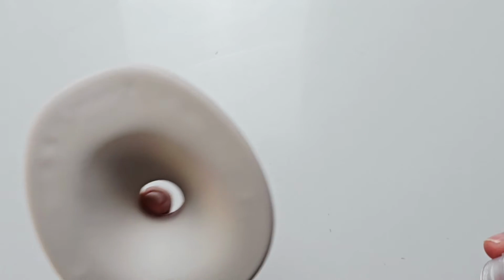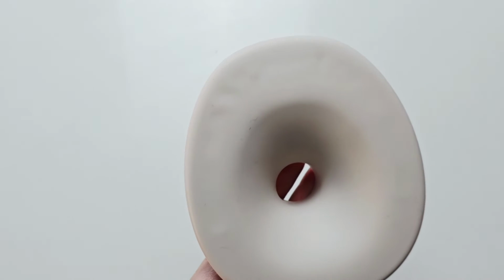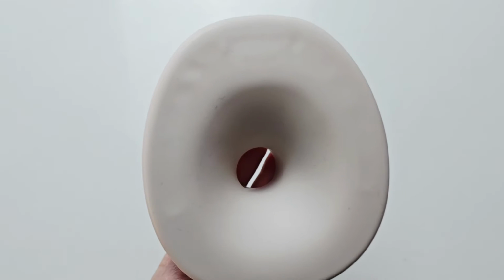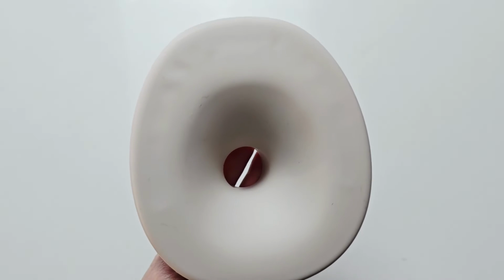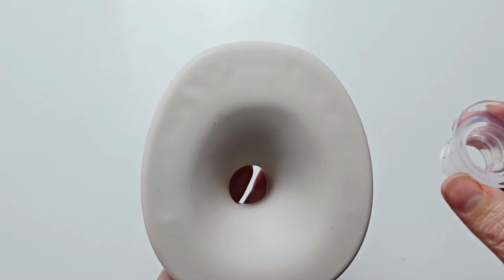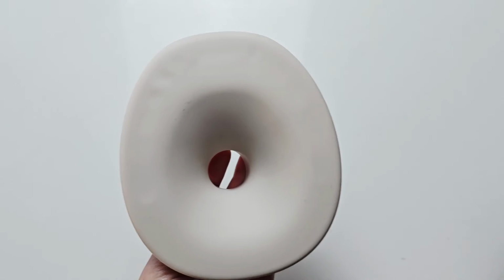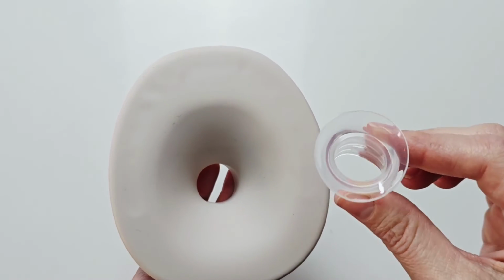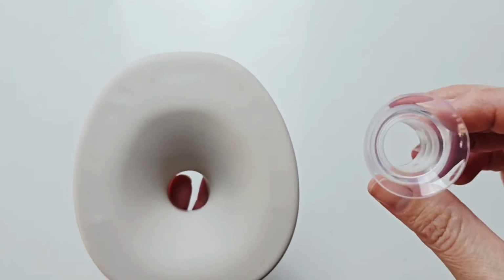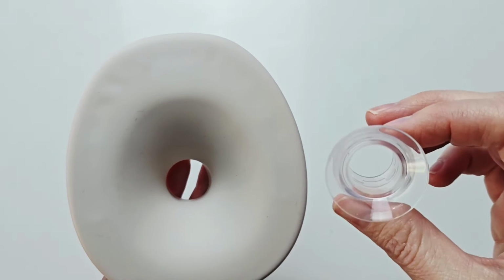So when you first start pumping, if it's straight after birth, that's when your nipple size is the largest. And then progressively, as you go down your postpartum journey, your nipple size will reduce. So you may find that over time and at quite regular intervals, you are needing to reduce your flange size diameter anyway. So you'll probably change your sizing before you wear out your flange insert.